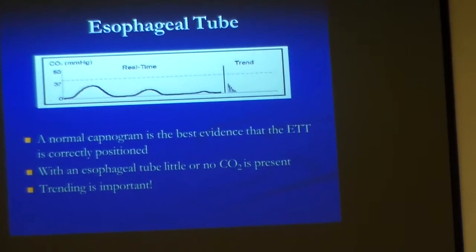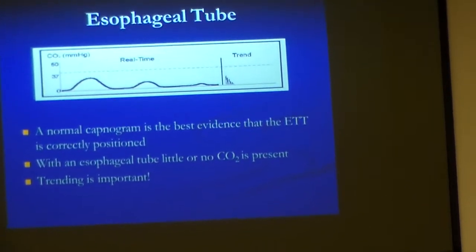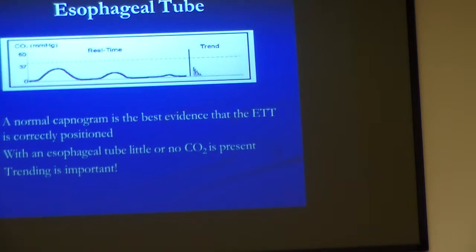There's little or no CO2, and remember, trending is important. Just because you got that initial little puff there, that's not a good waveform at all. You usually never see that kind of waveform, and then it just peters out. So that is an esophageal intubation.